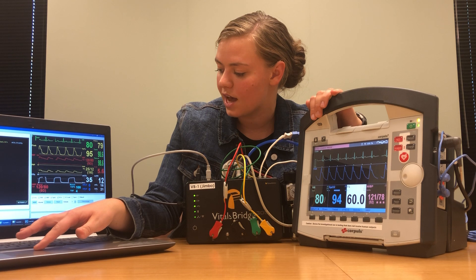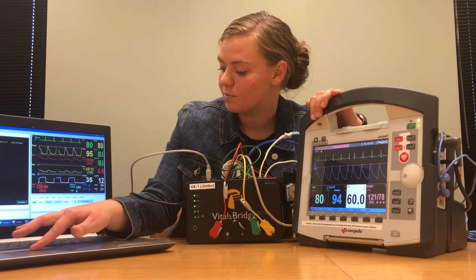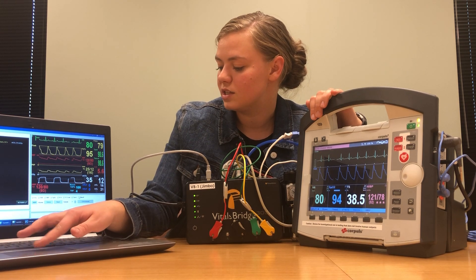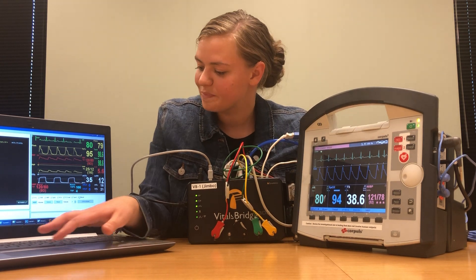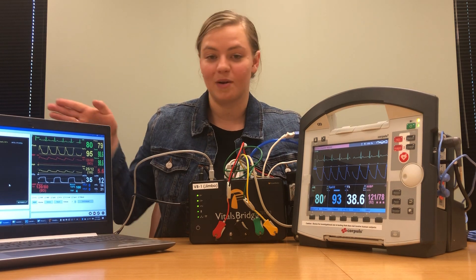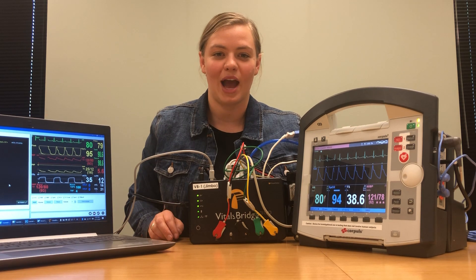I already have carbon dioxide, invasive blood pressure, SPO2, and ECG checked, but I don't have the temperatures, so I'll click those and we should see the temperatures update to what they're supposed to be. Then you can control your software from the simulator, or go back to the manual tab in the VitalsBridge connector app.